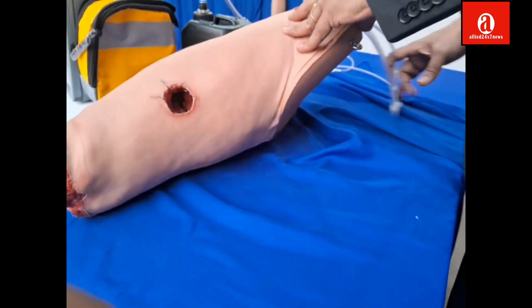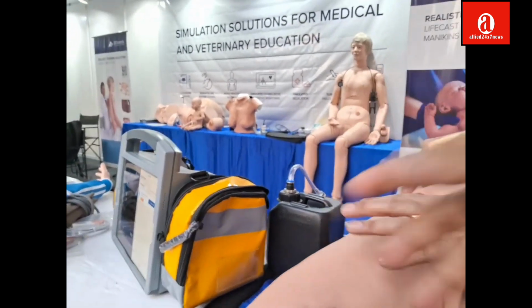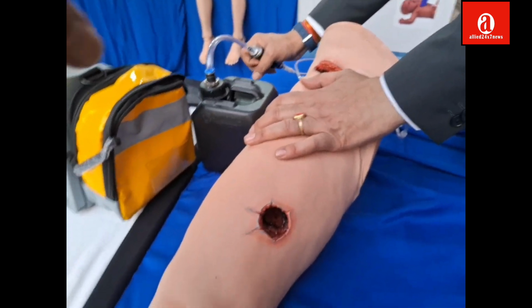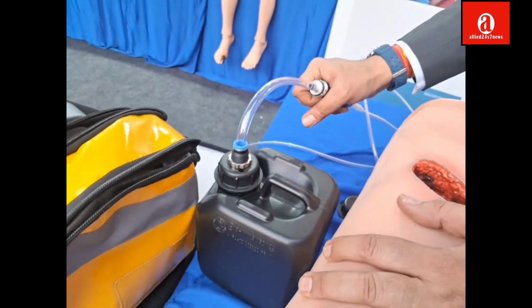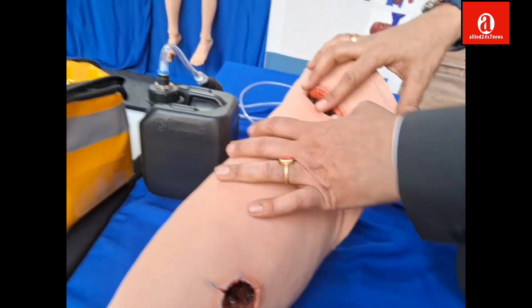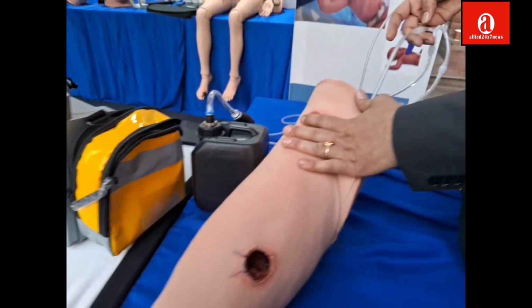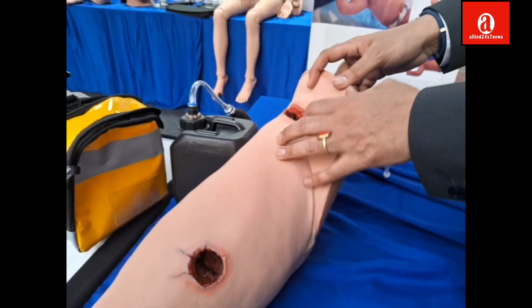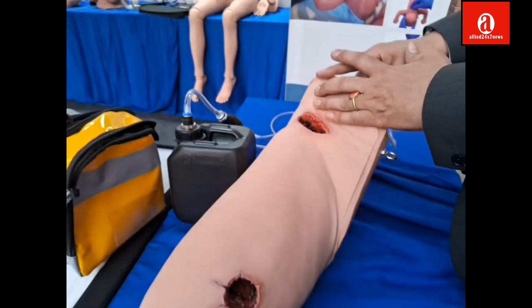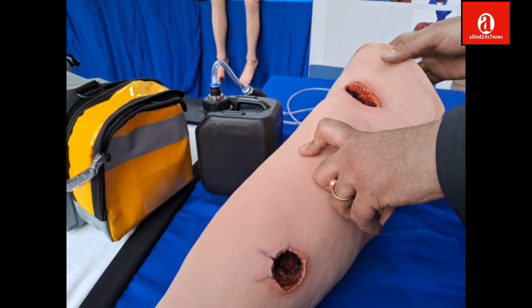These are the different tubes, each going into all these visible openings. We pull up the simulated blood, fill it up here, and compress the air inside, then it starts to flow automatically. Blood will come profusely. Bleeding would be there, and then we can control it. If we don't want bleeding in a place, they can put up a tourniquet and compress the system, and the bleeding would stop.